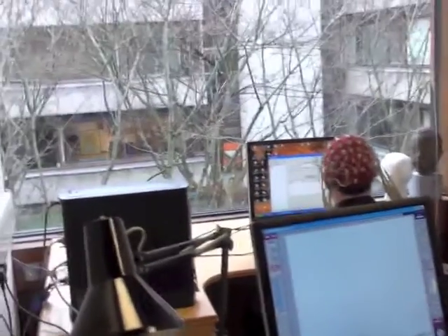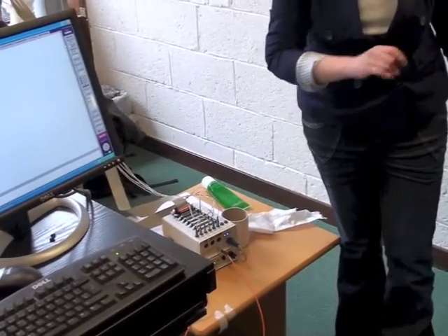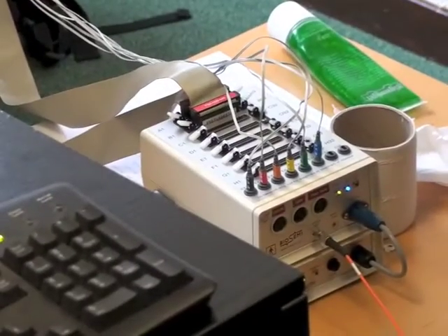See this light, this blue light here? I should have showed you that earlier. Before I plugged in the electrodes from his head, that was flashing, blinking blue. When I plugged them in, it should go solid blue, everything's good, and it is good, so that's a good sign.